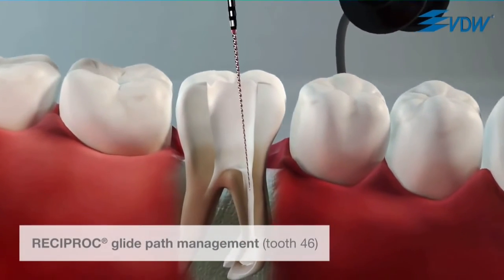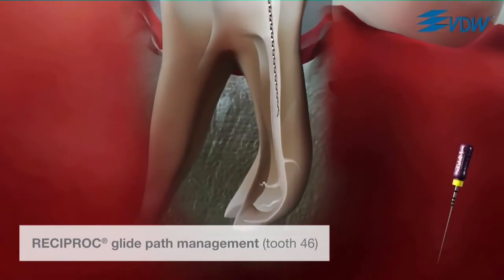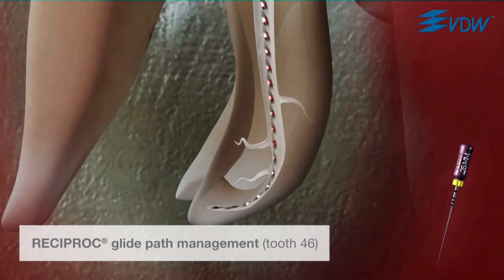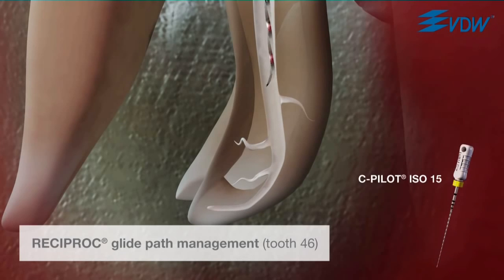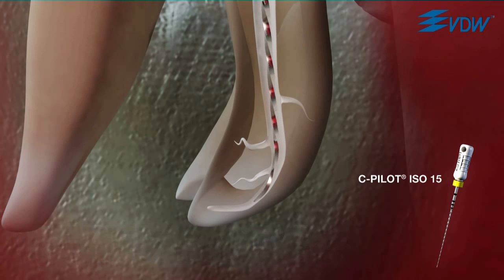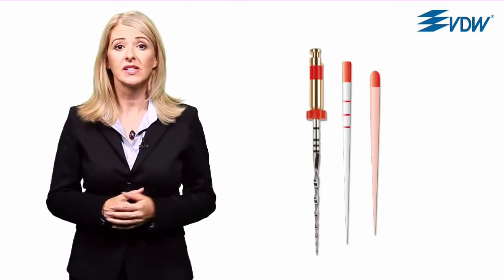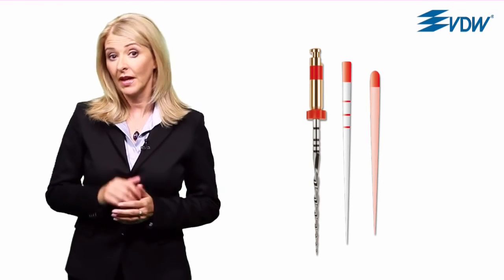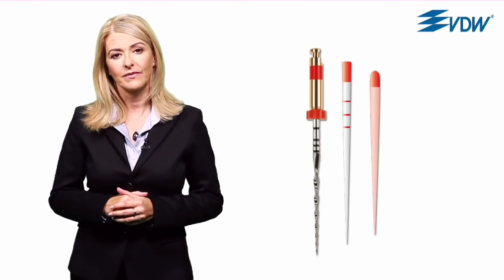In a few cases, it is possible that the ISO size 10 hand instrument can only reach working length if it is pre-curved. In this case, a glide path is created to ISO size 15. Following this, you can continue with the preparation. The Reciproc range also includes paper points and guttapercha in sizes 25, 40 and 50, compatible with the instruments.